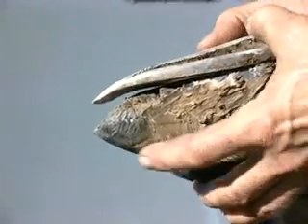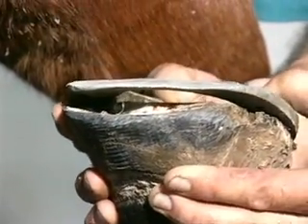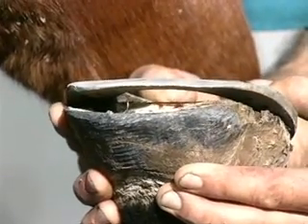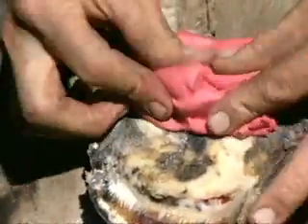The shoe is actually set on in the same plane we set the last case. We're going to be parallel now to the bottom of P3. Notice I can actually see under the shoe. I'm unloading the front and loading only the heel. This is so important, and it's such a tough area to actually teach.